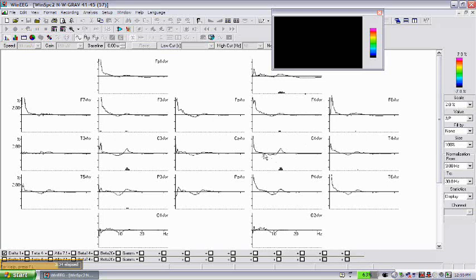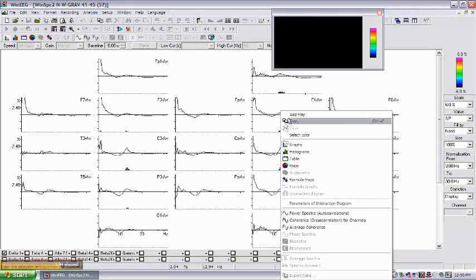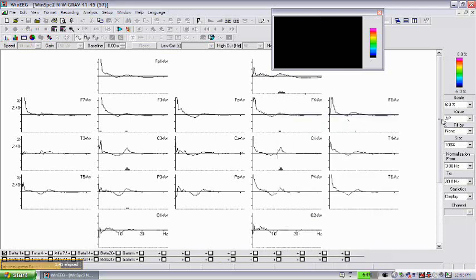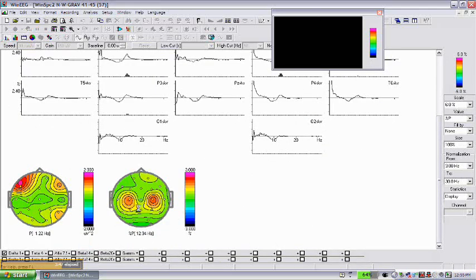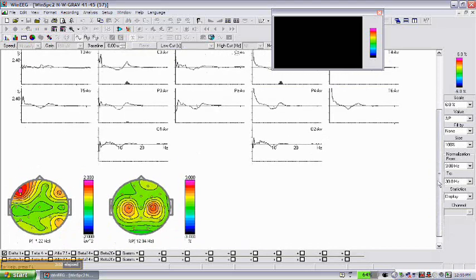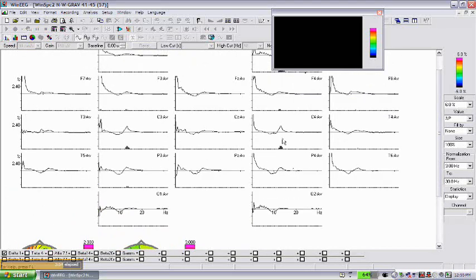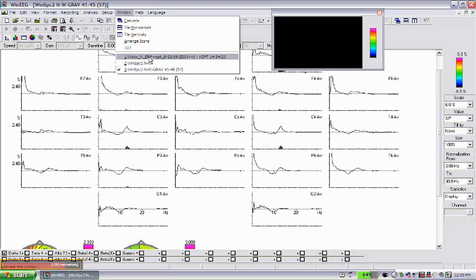In this normalization frequency band from 3 up to 30 Hz, in this normalization band you can see that this patient has excessive activity at frequency band about 13 Hz. It's probably mu rhythm which is generated over the sensory motor strip, and quite high frequency band.